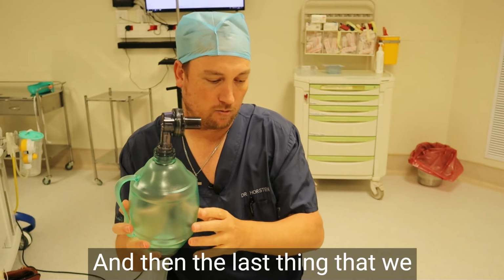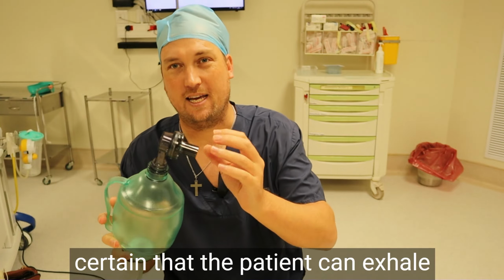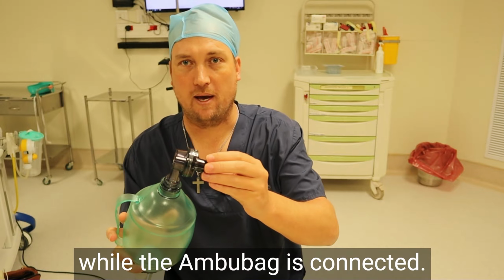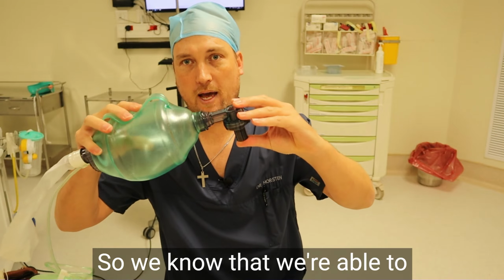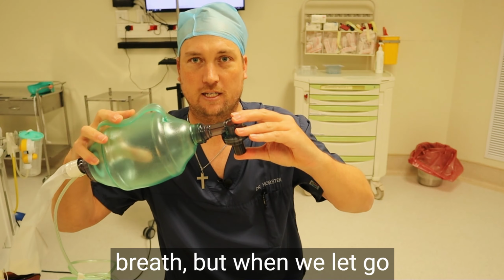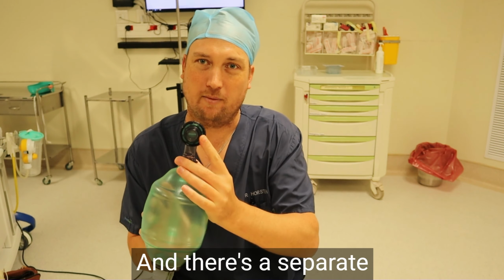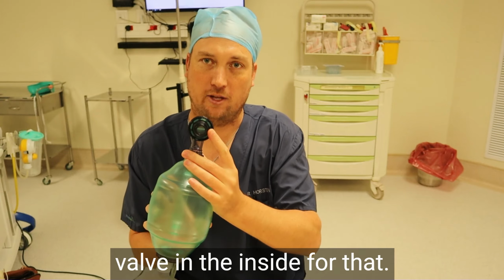And then the last thing that we want to do is to be certain that the patient can exhale while the ambu bag is connected. So we know that we're able to generate a positive pressure breath, but when we let go, is the chest going to be able to exhale and decompress? And there's a separate valve on the inside for that.